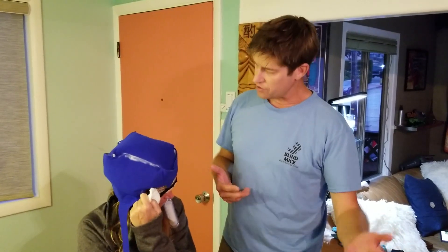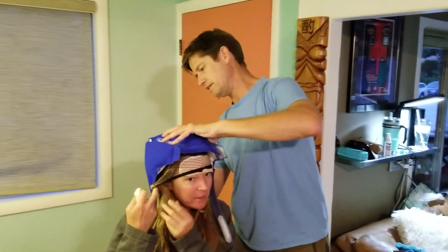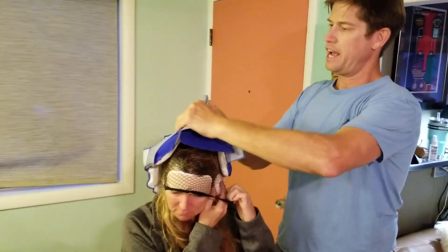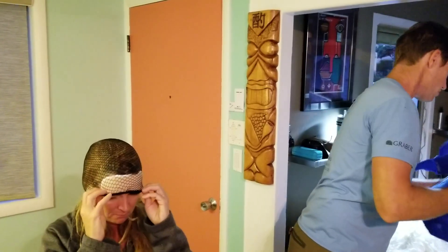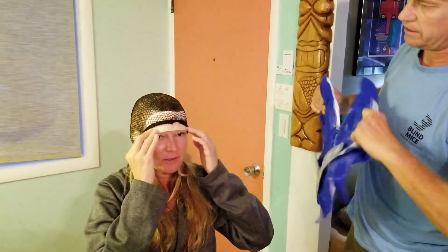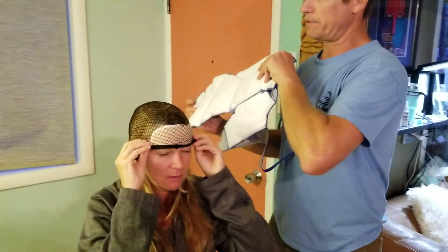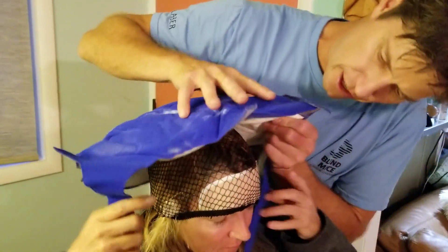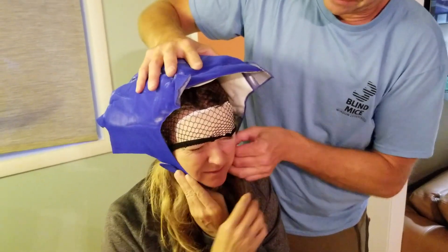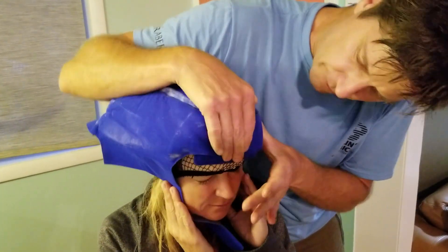Don't make changing on the road a big deal — just pull off, change it, and get back on. We had to change it twice one time. Renee's got some pads to keep her ears from freezing, and she pulls her hair over her ears for extra protection. To take the cap off, just grab from each end and pull. She's got a hairnet on. I have a maxi pad underneath but it wasn't enough insulation, so I put moleskin over that. The key is to get that next cap on quickly to stay cold — put the chin strap on nice and tight.